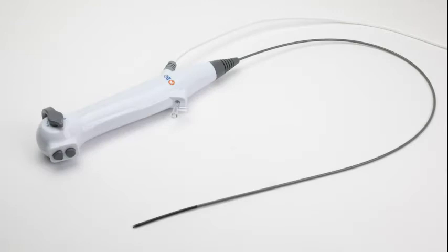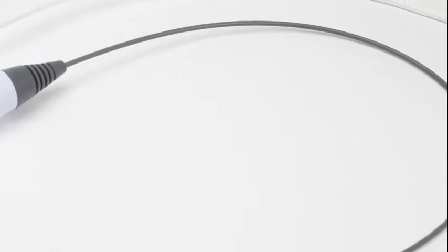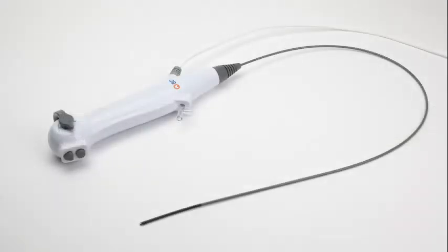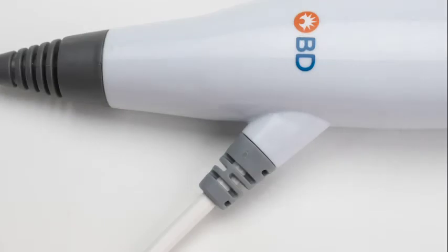The BD-APTRA single-use digital flexible ureteroscope is comprised of a handpiece with an articulation lever, accessory and irrigation ports, and the flexible insertion tube. The insertion tube has three distinct sections: the tip, which is located just distal to the deflection section, and the remainder of the insertion tube. The working length of the insertion tube is 67 centimeters. There is a strain relief where the insertion tube connects to the handpiece. The handpiece consists of the accessory and irrigation ports, the handle, and the articulation lever. A cable extending from the handpiece connects to the image processor.